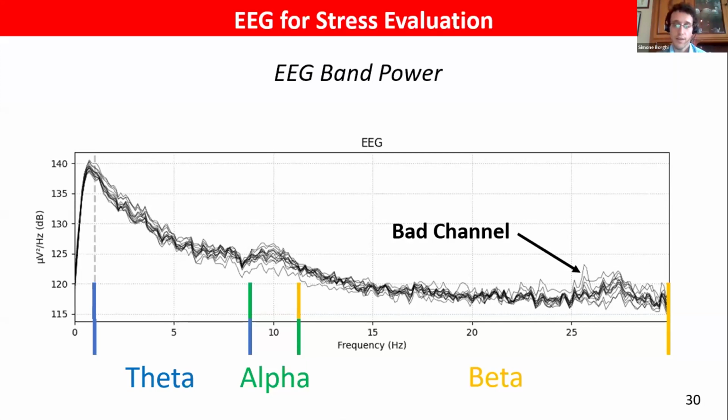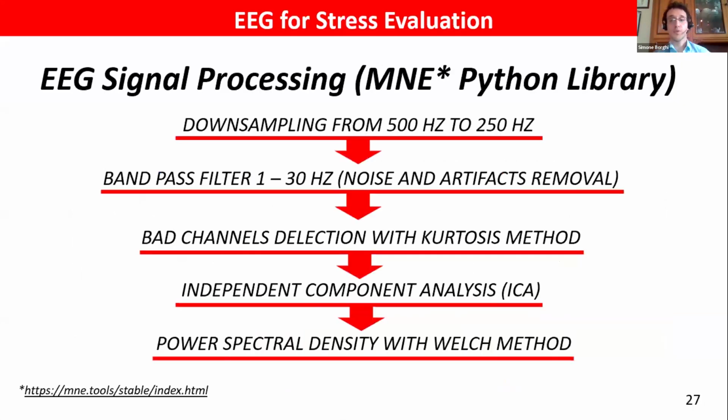It is therefore outlined that the preprocessing of the EEG signal is fundamental for correct analysis and interpretation of the EEG signal, especially in very dynamic tasks such as the one in the industrial context. Here I propose an outline of my approach to analyzing EEG data from this experiment, which I employed personally but recognize as open to refinement suggestions. I use Python along with the MNE library, tailored specifically for EEG analysis.